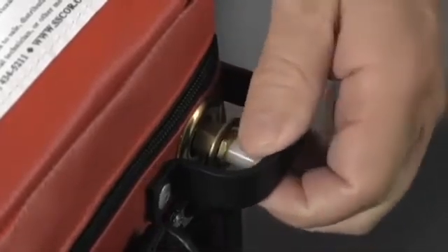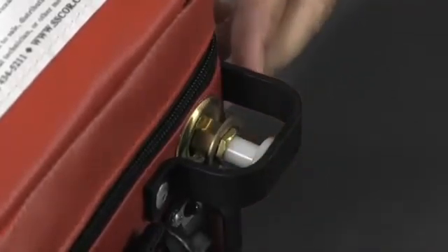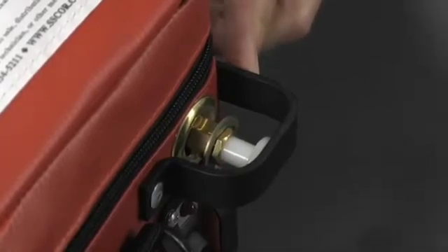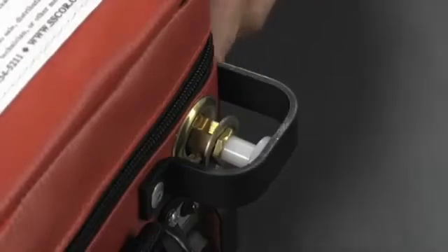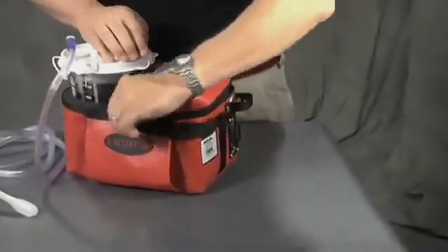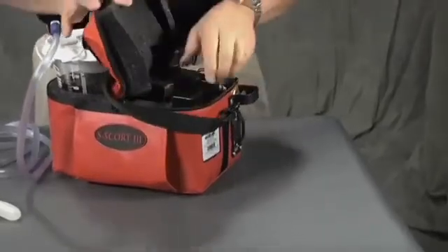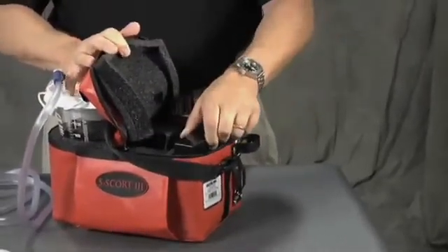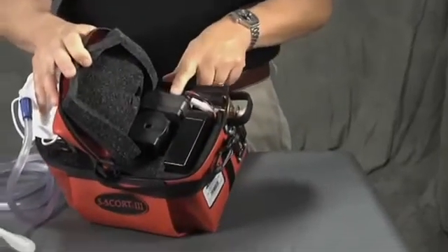Pull out the button and the vacuum level drops to approximately 125 millimeters of mercury for tracheal suctioning or other procedures where lower vacuum is called for. The Escort 3 is easy to maintain. It generally requires no maintenance other than the occasional battery replacement, which is very easy to perform. Should any other repair be necessary, all components are readily accessible.